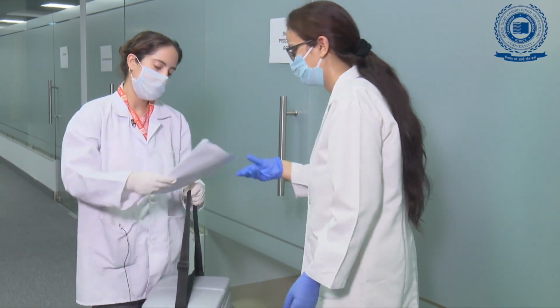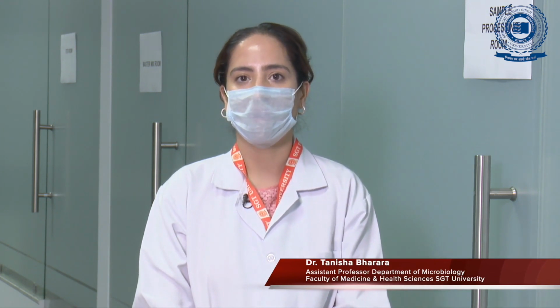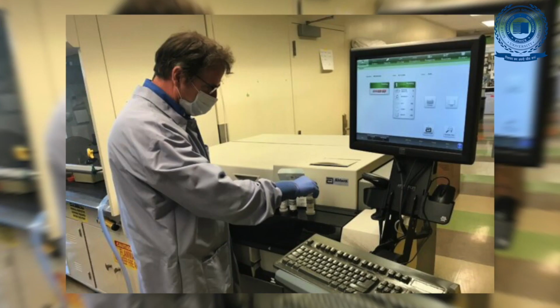So the sample has reached the Department of Microbiology. In the laboratory, the sample is transferred to the sample processing room. There the technician takes all the precautions as per biosafety level 2 and starts processing the sample, that is extraction of viral RNA. After extraction of the RNA, the specimen is rendered non-infectious. Now it is transferred to the master mix room. After the master mix room processing, the final step is done in the real-time PCR room.